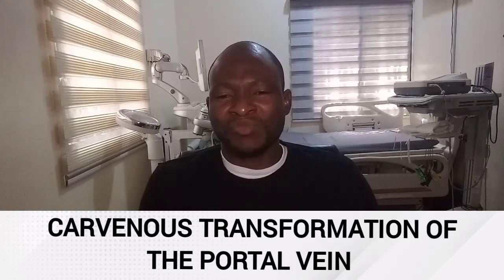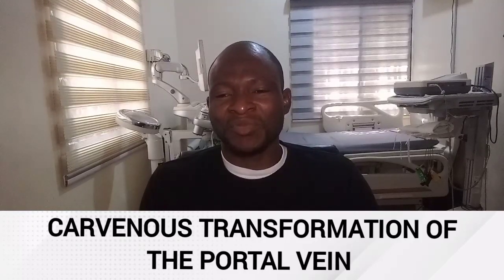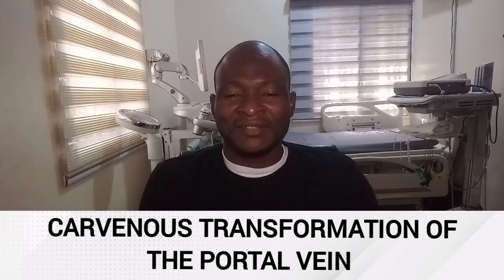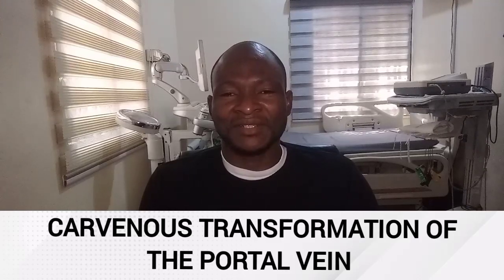The thrombosed main portal vein is usually not visible on grayscale sonogram because of numerous periportal collateral veins in the expected location of the main portal vein. Color Doppler sonography demonstrates the absence of flow within the main portal vein and color flow in the periportal collateral veins. The flow in periportal collateral veins is in hepatopetal direction and has a portal venous waveform.